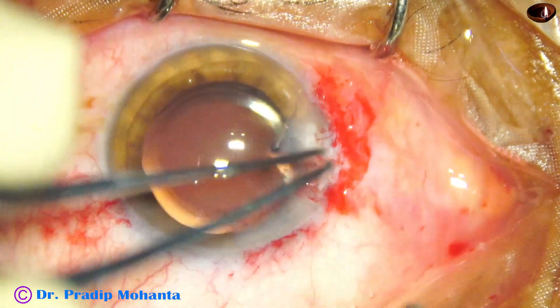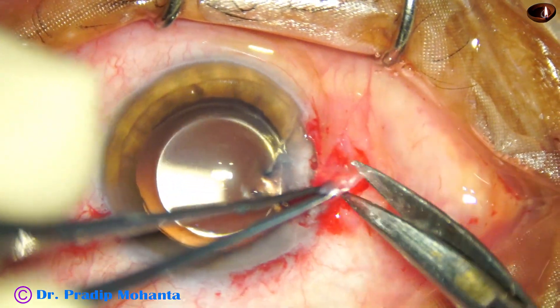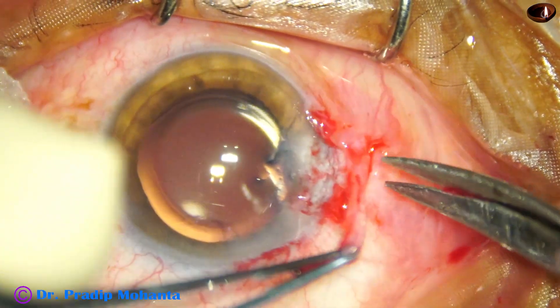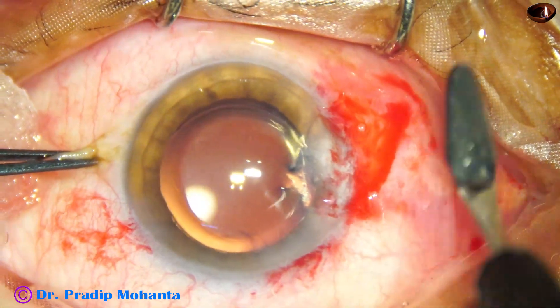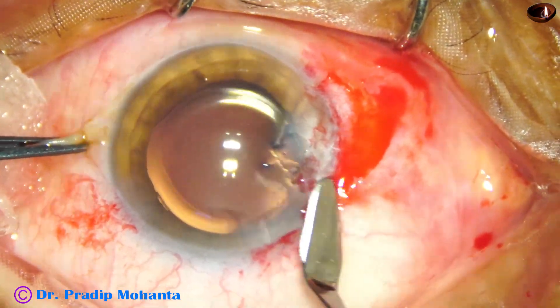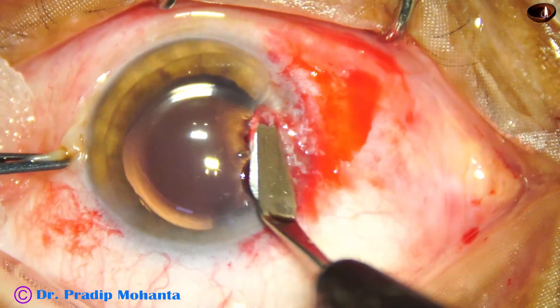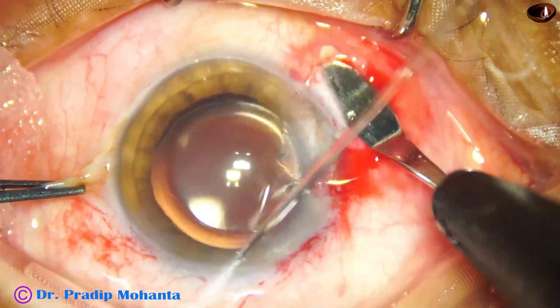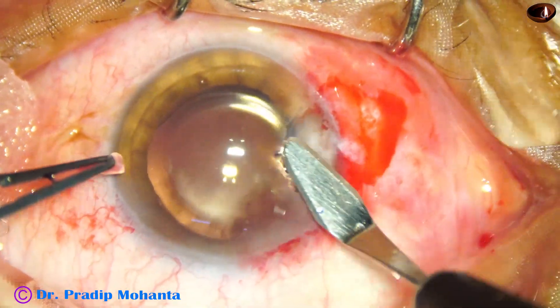Now I remove a bit of subconjunctival Tenon's tissue. Along with cataract, we do this bare sclera technique of pterygium in many cases and most cases do very well. Recurrence is very less because in these older patients the pterygium is usually stationary — the epithelium covers the bare sclera. In younger patients the recurrence is more. And this is trimming of the pterygium.